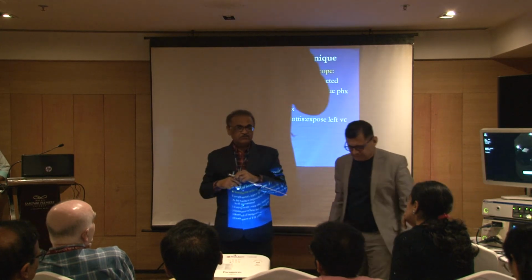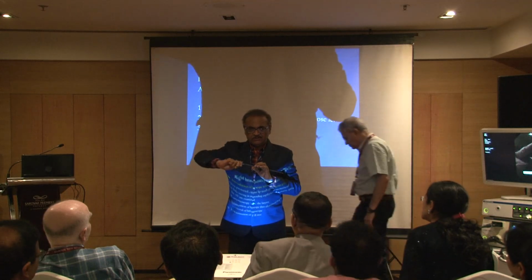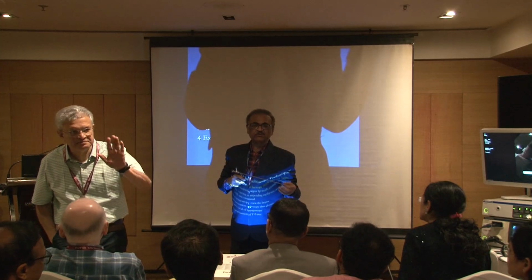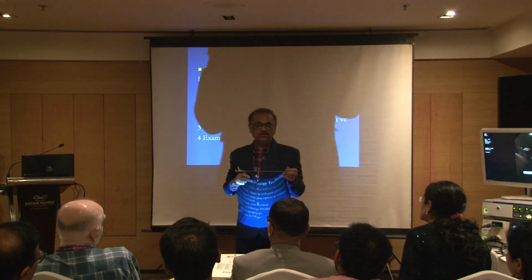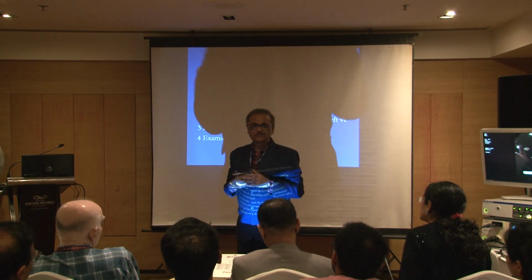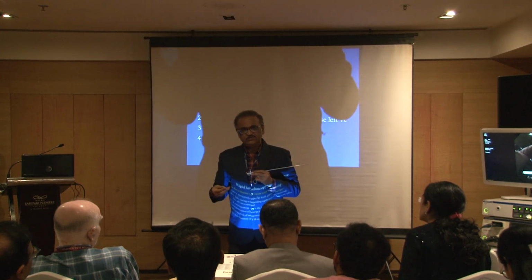Now what happens normally or practically is maneuverability with the forceps at the deeper level is difficult. These forceps are not sturdy for maybe tamarind or chiku seed or custard apple seed. So there they are not stout. So we have to resort to a normal forceps. Even if you know advanced technique, you need to know basic techniques also.